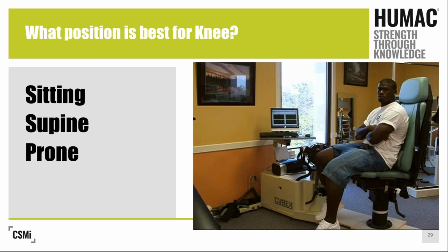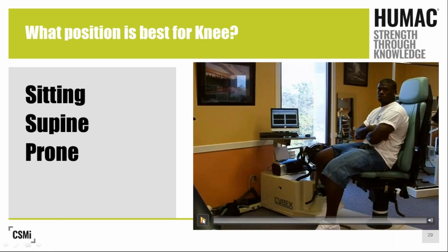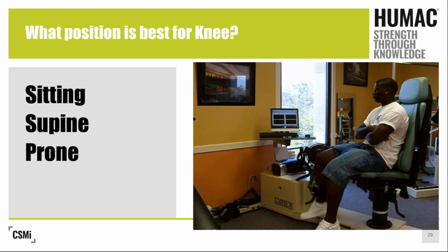So here's another question I'm going to pose back to you guys. What position is best for the knee? Is it sitting? Is it supine? Is prone even better for us than just a sitting position? I think we get used to sitting. It's an easy way of doing it, and they can see the screen and everything along those lines. But are there other positions we might need to get our patients into in order to make it a little bit more effective?